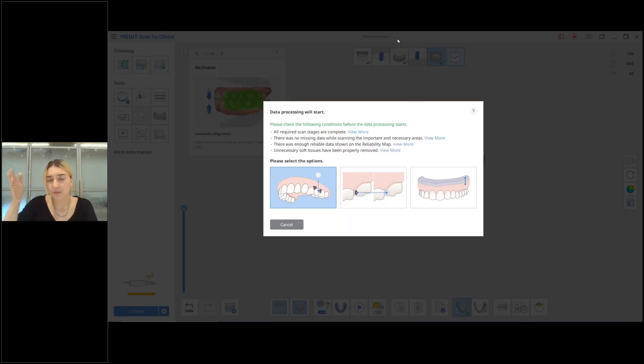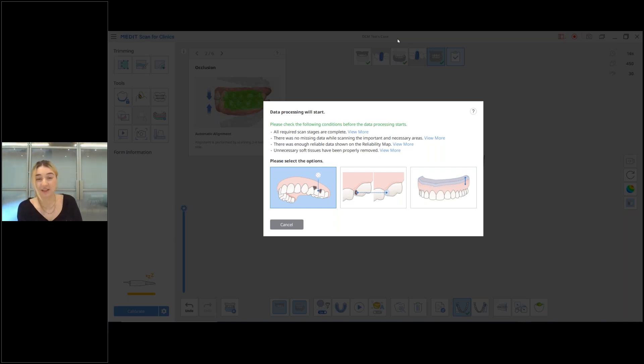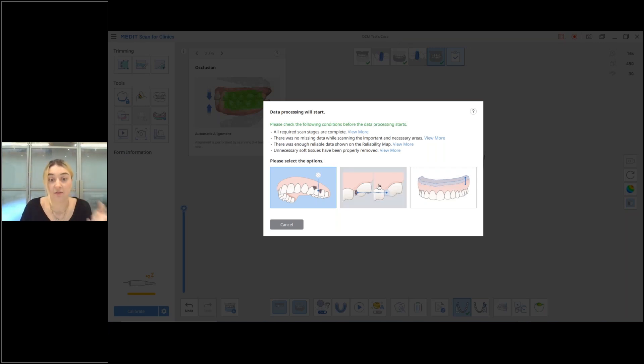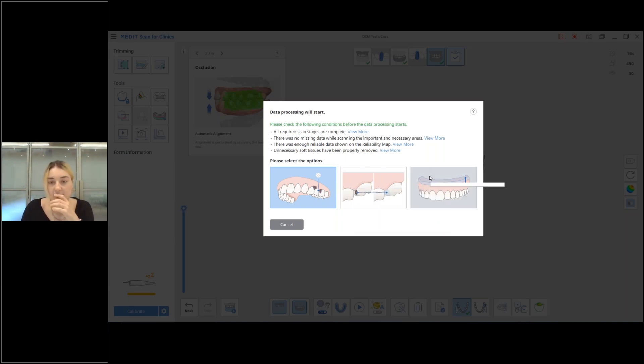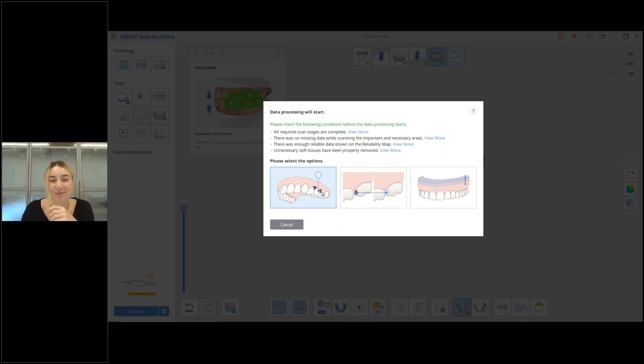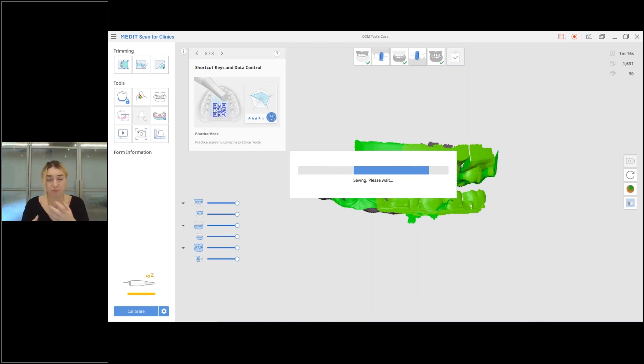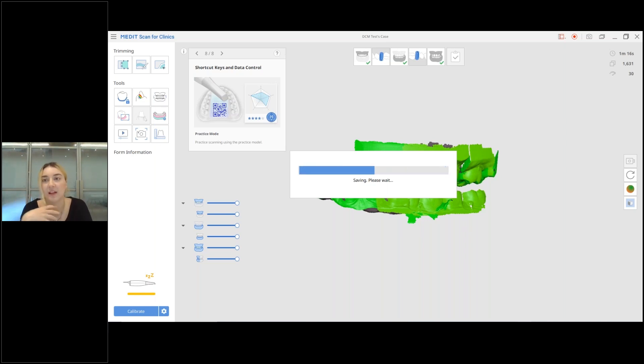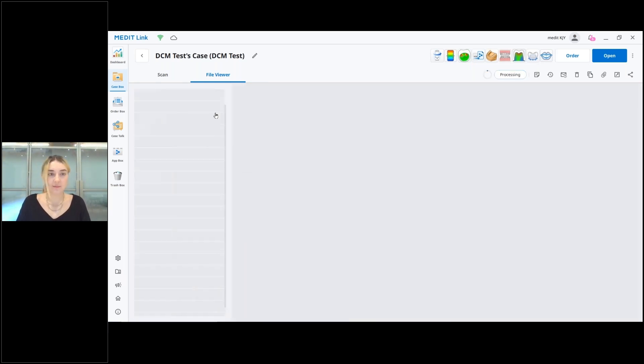Now that I took the occlusion scan, I'm just going to go to the complete stage where I have this option to choose among the three options about how I would like to handle the empty spaces, the holes in the scan data. I can actually just leave it as it is or I can fill them. This function used to be in MediLink, now it's back to Scan for Clinics, and then I can create a 3D printable model, but probably you would want to do this in Model Builder now. I'm going to use this one which would leave my data as it is. So the whole scanning process is being finalized and then the post-processing will start in MediLink.